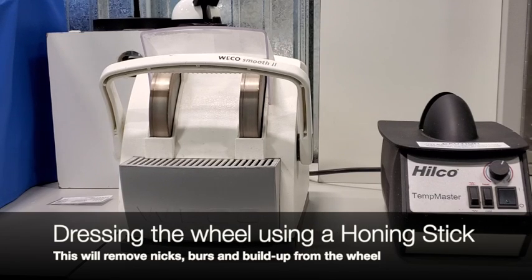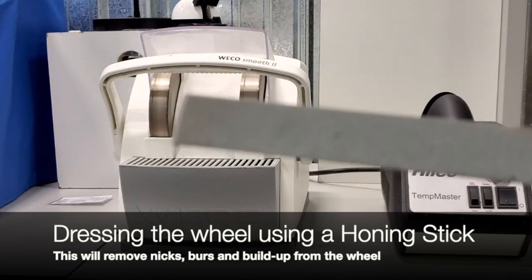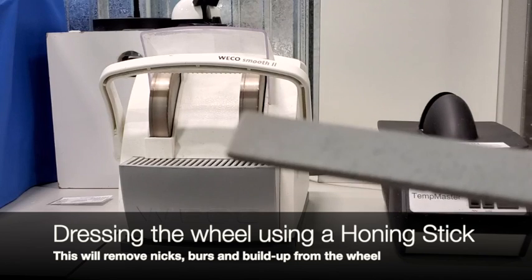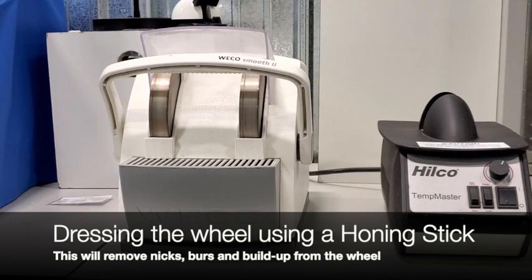In order to dress your wheel, you're going to want to use a honing stick. A honing stick is like a stone. They sell them, and you guys should have one in your lab. Basically, this is going to take any nicks and burrs out of the wheel to give you a nice smooth finish. So in order to dress a wheel, you'll go ahead and turn on your unit.